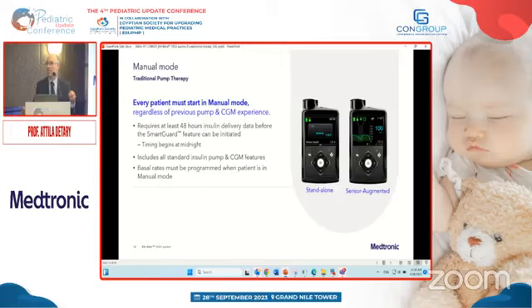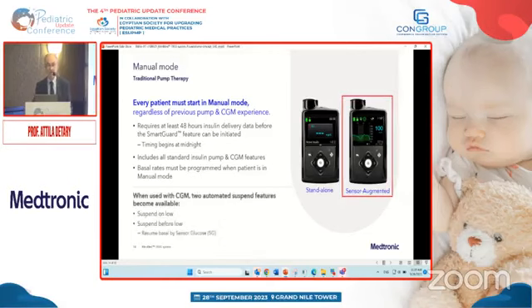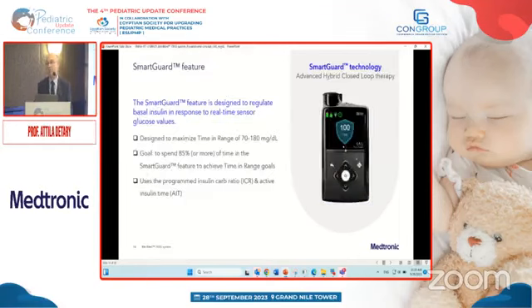As soon as you start using continuous glucose monitoring, the screen changes and you have a curve on the screen. So now, if you are still in the manual mode, you will have much more information about the glucose levels because you see the curve on your pump. And in this, you can already set some features which prevent the patient from hypoglycemia. They are called suspend on low or suspend before low. However, the real benefit is the automated mode, or auto mode, or SmartGuard feature.